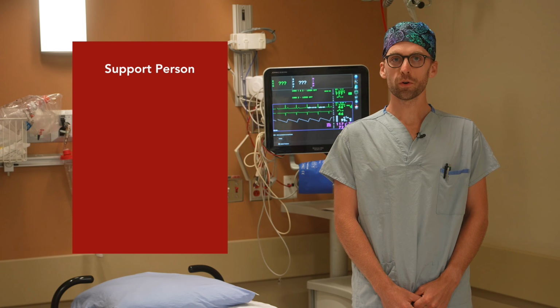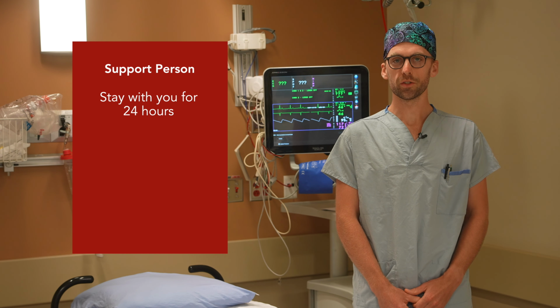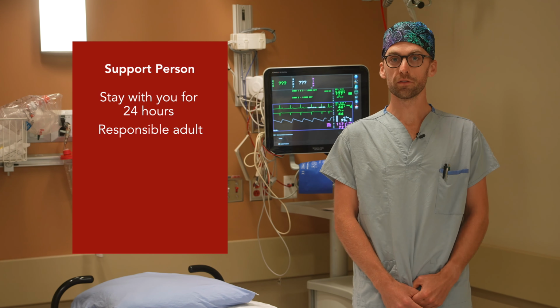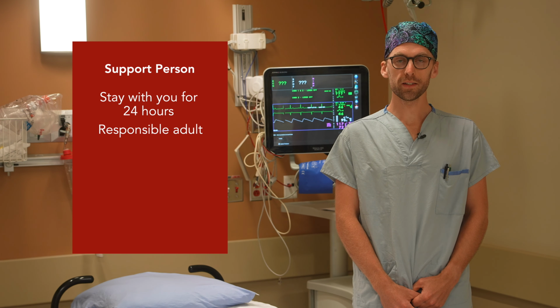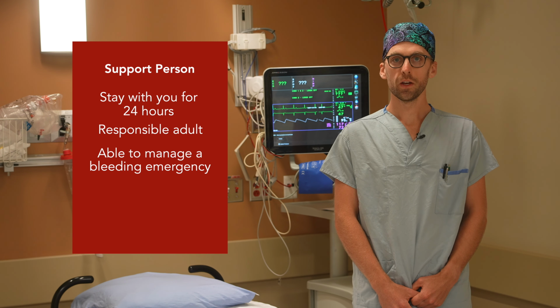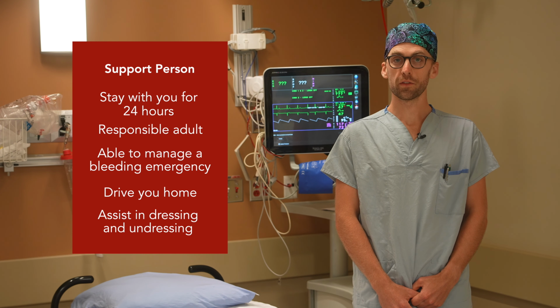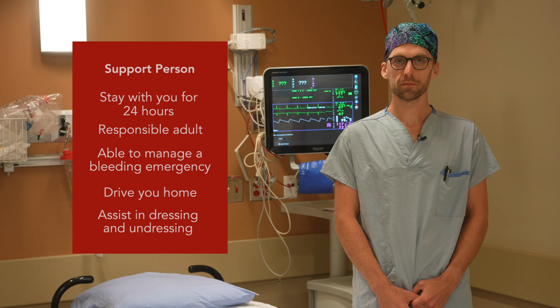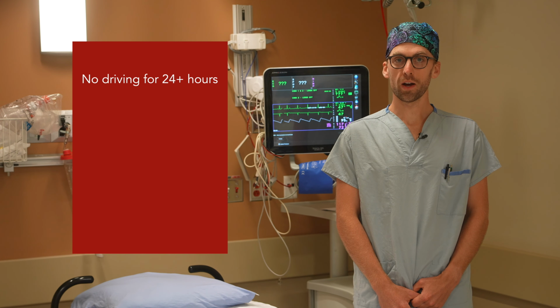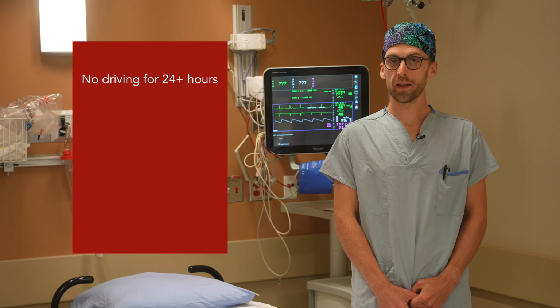You require a support person who will stay directly with you for 24 hours after the procedure. This person must be a responsible adult who is physically and emotionally able to manage a bleeding emergency. Your support person will drive you home from the procedure and will need to assist you with getting dressed and undressed for the first 24 hours. You will not be able to drive for 24 hours after your procedure, and this might be longer depending on additional procedures you might have.